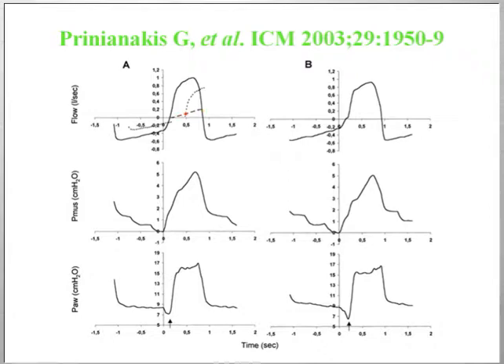And the inspiration to expiration switch is still determined by a conventional decay in inspiratory flow, or it's determined by this electronic signal, this dotted line which you see here, which is proportional to inspired volume. And they tested this new system against a conventional one, which is shown here, with conventional flow triggering and a 25% cycling-off criterion. This is the Dräger Evita 4 here to the right. This is the Respironics Vision ventilator to the left.